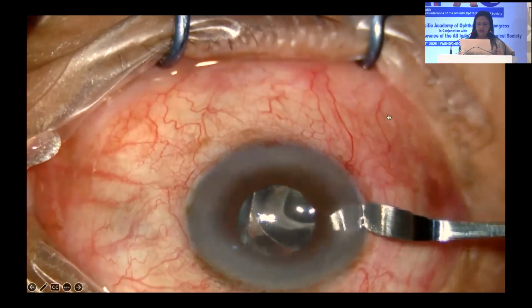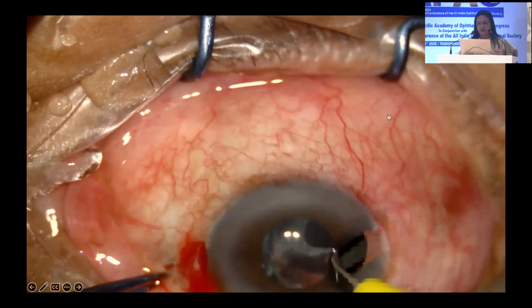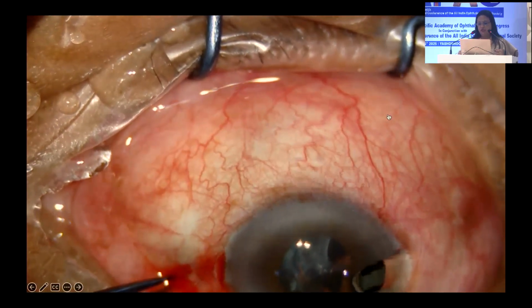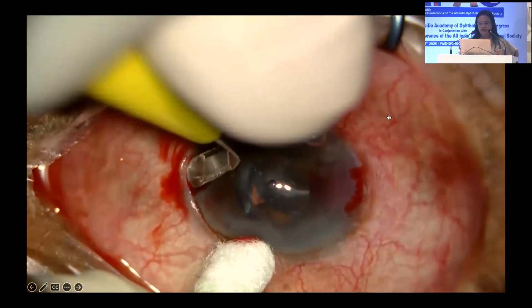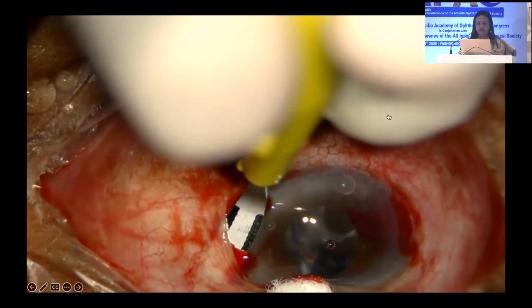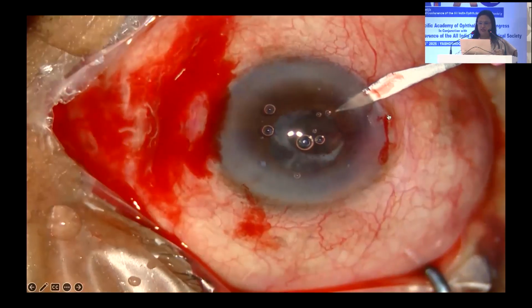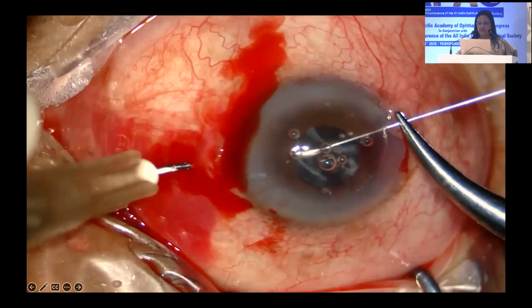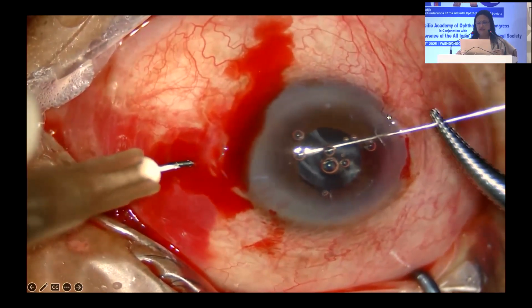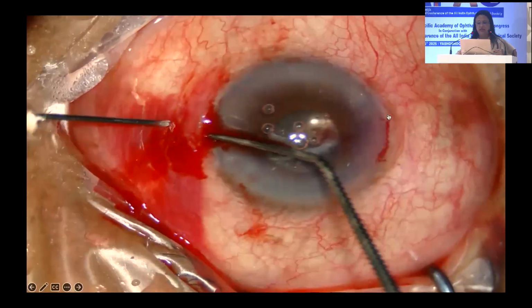Here you can see I'm creating a Hoffman's pocket, and the most important thing while creating the pocket is to make sure that you have adequate space. If you don't have adequate space, then you might inadvertently put the needle through an area where there is no pocket. So you have to check the pocket. Now you can see I'm going through with a 27 gauge needle, and I'm threading the 10-0 polypropylene into it, railroading it.